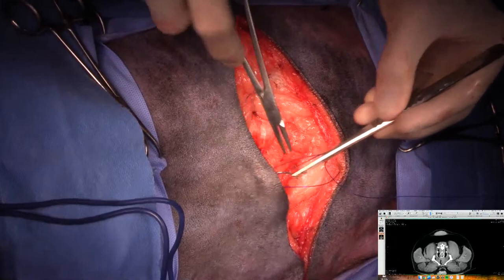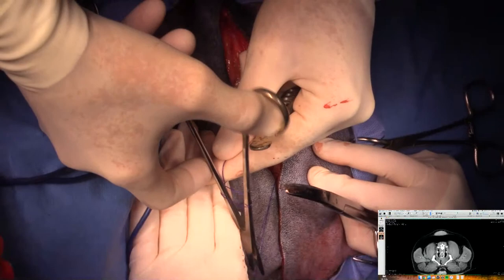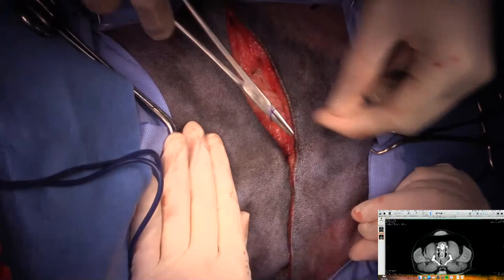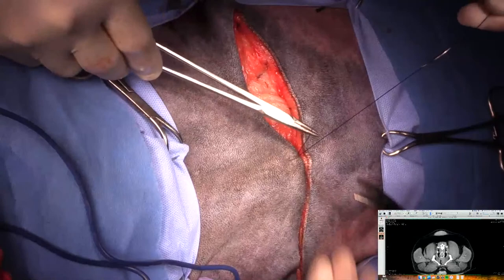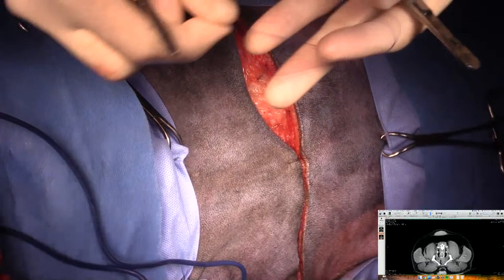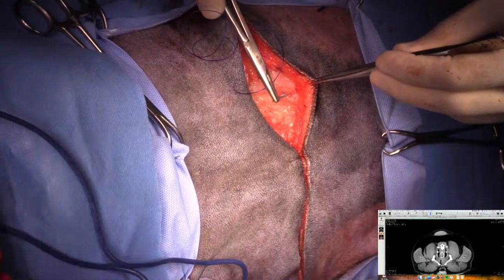Is that going to come together? Is the question. And we'll just do a skin injection of the mepivacaine, because the skin is really the only layer that's going to be painful here.